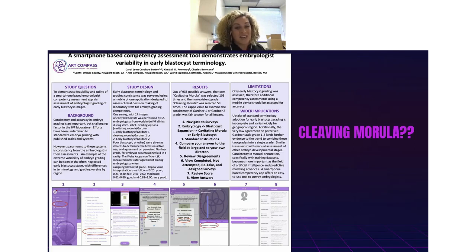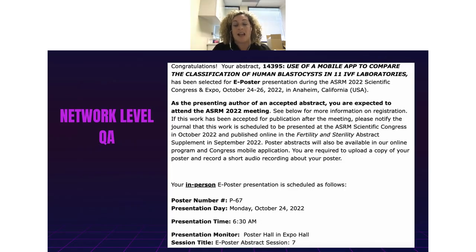And so we got some very interesting data here about the wideness of terminology still in use for early blastocyst grading, and the ability to have people select a grade for an embryo that doesn't exist by presenting it that way. And so I think surveys like that can be very enlightening for lab directors. You can ask yourself, do you think that your staff could ever pick an answer like that? And then deploy the survey and see what you get.